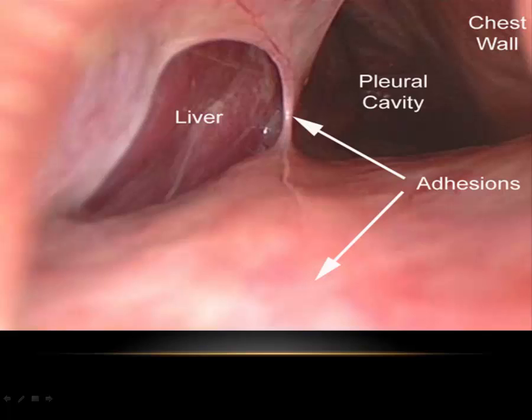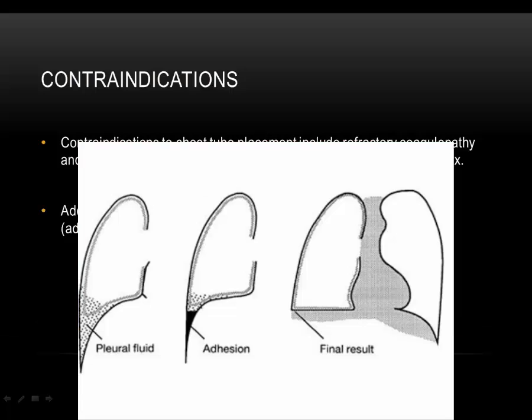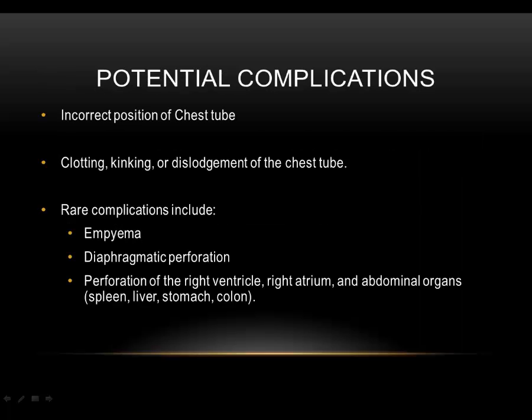Adhesions are the fibrous bands that form between tissues and organs, often as a result of injury during surgery. They may be thought of as internal scar tissue that connects tissues not normally connected. Some complications can include incorrect placement or kinking of the tube, and rare complications like empyema or perforation of the internal organs.